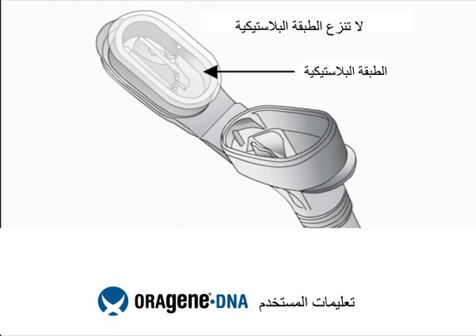The flip-top funnel lid contains a clear solution that will be mixed with the saliva sample when the kit is closed.